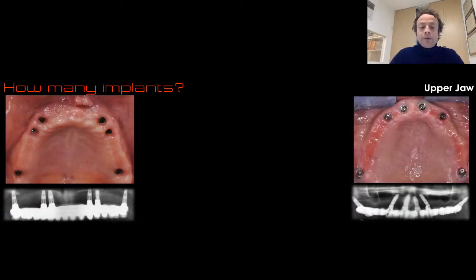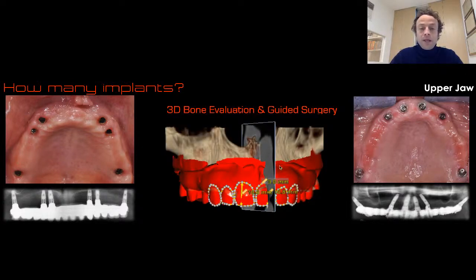Sometimes in the upper jaw we have situations that, anatomically speaking, are really complicated, and with the digital software it is really a good option to look for the best implant sites where to place the implant. And sometimes we also go into the tuberosity area, where we sometimes have really good bone, soft, really soft, but at the same time good from the biological standpoint. In that way we can use this implant in order to reduce the distal cantilever.